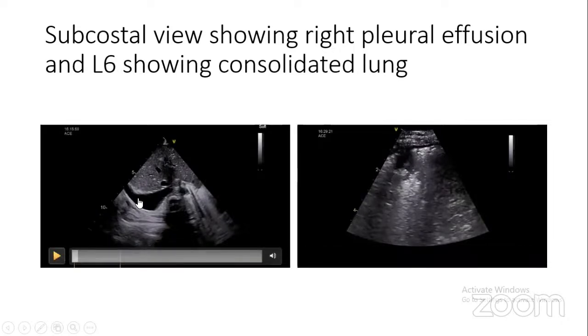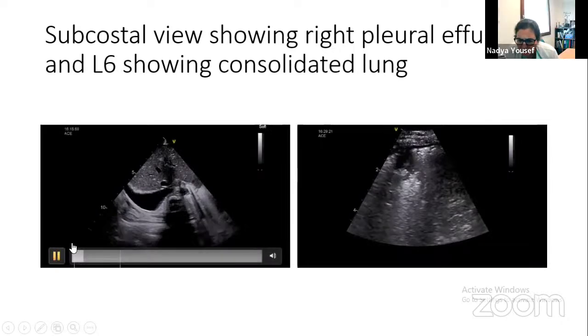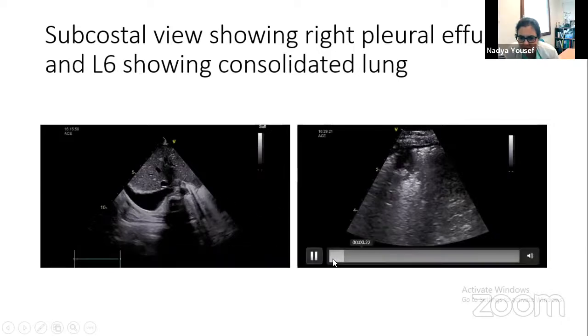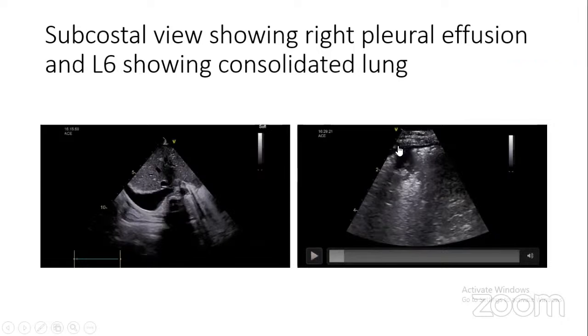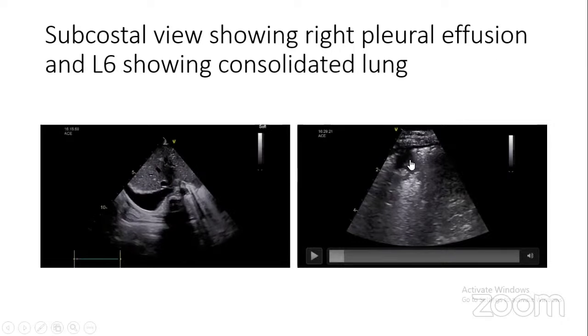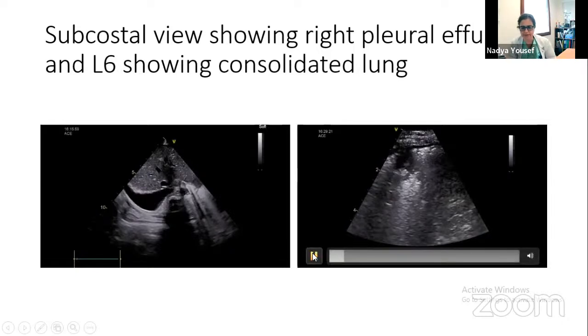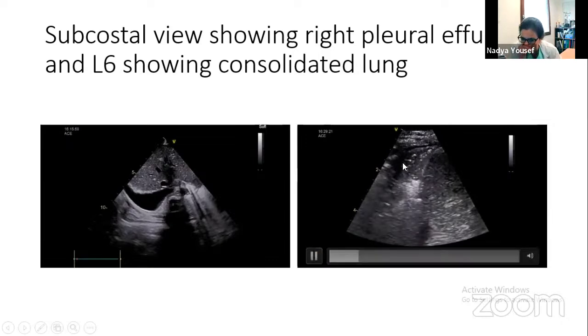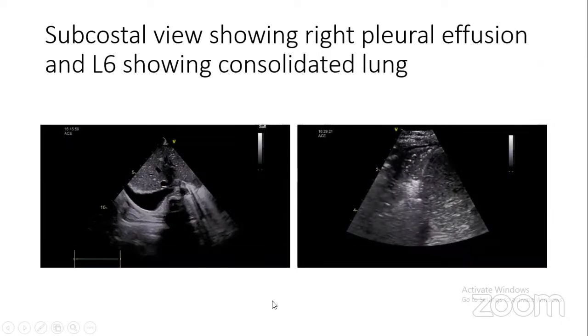It's hepatized. Could you just describe, please, you've got a hepatization and then this rounded area on the other one, the one that's not moving. This one is pleural effusion. Right side. This one? Yeah, this one, the round thing. Is that a consolidation or is that effusion? There is effusion. The rounded thing in the middle, what is this? This is hepatized lung, actually. That's fine. I don't know why it is not moving, but yeah, I can see it's hepatized lung.